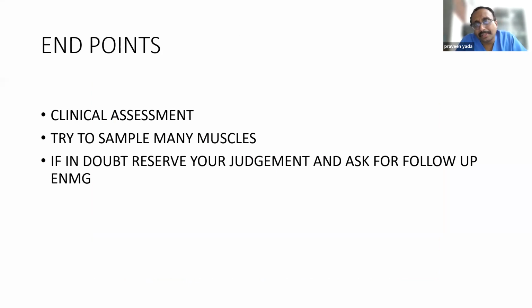Many times we think of something, we think of an MND, especially a bulbar onset MND, but we don't find anything, even in the tongue. Don't write it off, saying no, this is not MND. You should give time. Ask the patient to come after 3 months so that you will again do it and find out.